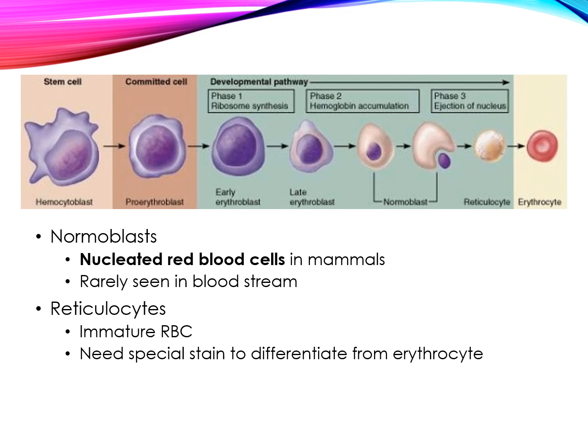Next is the reticulocyte phase, and the reticulocyte no longer has the nucleus, as you can see, but it does have some of the RNA left over in it. And again, it is normal to see a few reticulocytes. Same thing, if there are more in the blood, this may signify a problem. And then lastly, we have our mature erythrocyte.